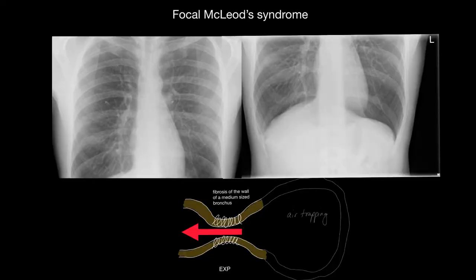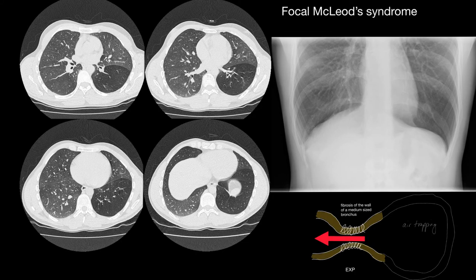Here is a case of focal McLeod syndrome. The lungs are completely normal with the exception of the left base, where there is attenuation of blood vessels — the number and size of blood vessels are reduced — and there is an area of lucency giving rise to air trapping. The CT demonstrates some bronchiectasis, attenuation of vessels in terms of number and size, and an area of air trapping. Note that the oblique fissure is bulging anteriorly because of the volume hyperexpansion in this left lower lobe.